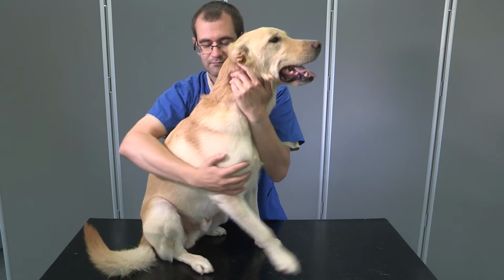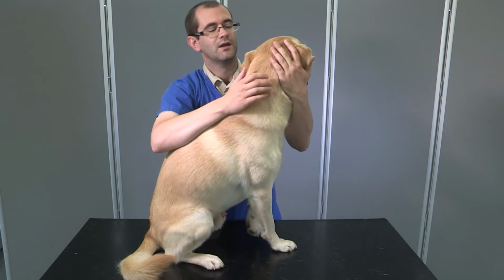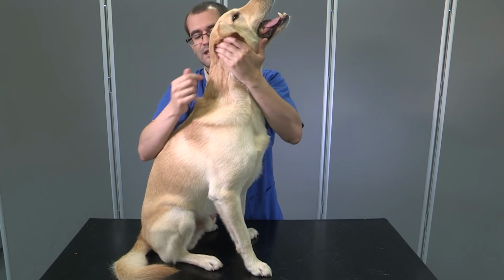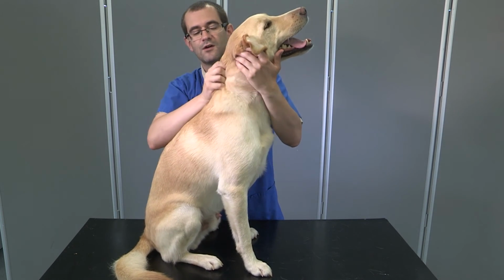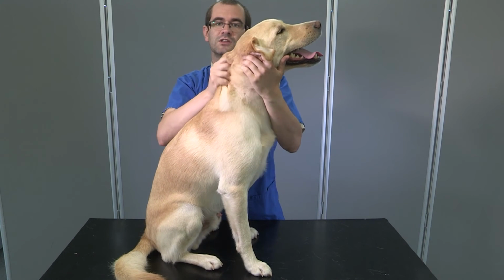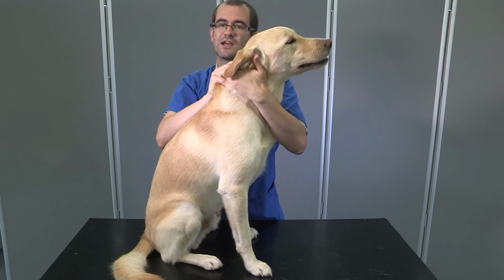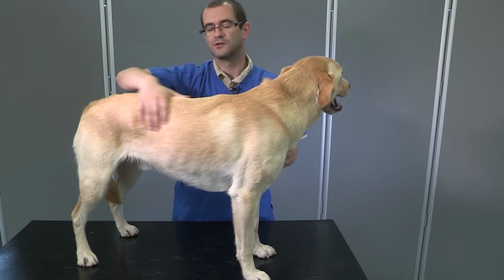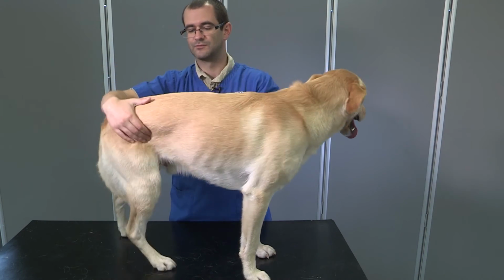So turn, good boy. You can stretch out the skin and then just inject straight in there. Or if it's a slightly fractious dog, you can grab a handful of scruff and inject into the muscle there as well. Working caudally, we have the epaxial muscle group here.